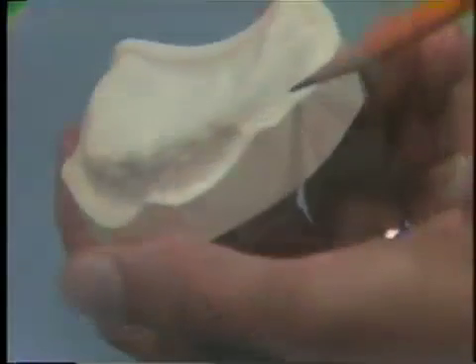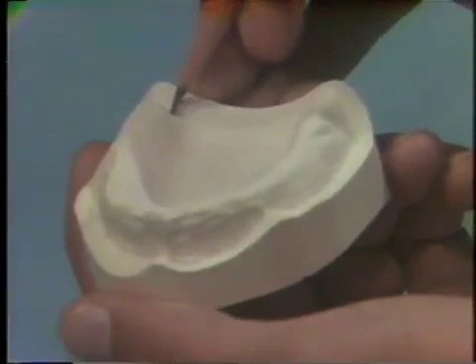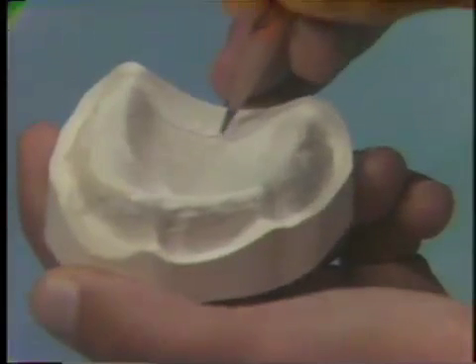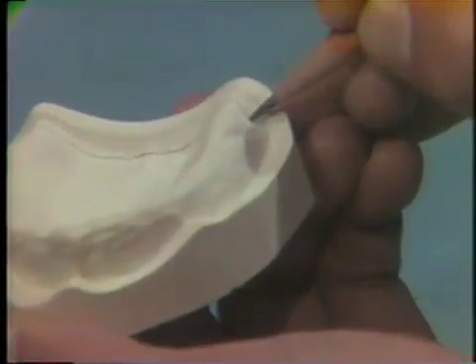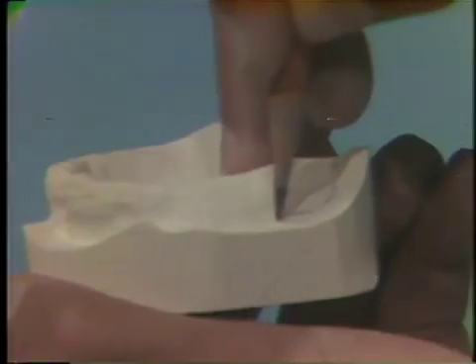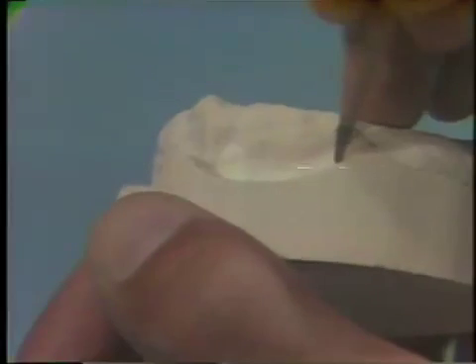The preliminary impression taken in alginate is usually overextended on the peripheries, so you'll need to draw a denture base outline for the final impression tray on the diagnostic cast in order to provide maximum coverage of the basal seat area. Using a pencil, draw a line one to two millimeters short of the sulcus depth that was registered in alginate. Give careful attention to the frenula in the buccal and labial areas to provide adequate relief while maintaining the required denture base outline.